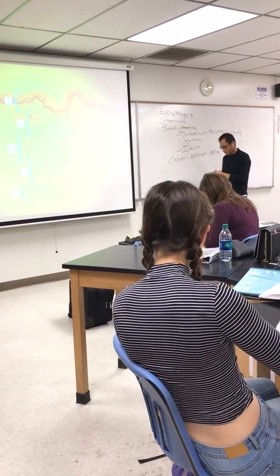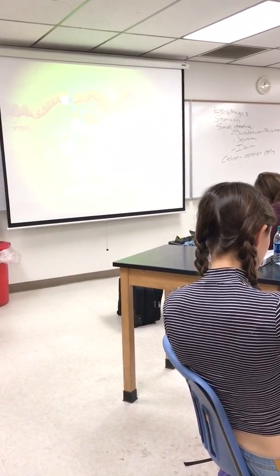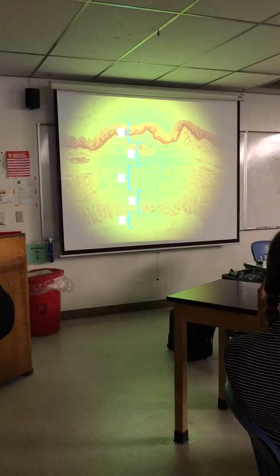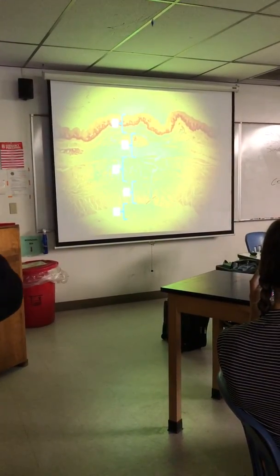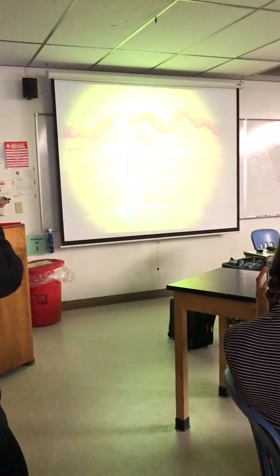So I'm going to turn off the lights. I know it's hard to see in the dark, but I'll leave that up there. This is the esophagus. And basically, you're seeing the whole thing under low mag. And the reason why I have the labels here is so I can ask you to identify the different layers. That's mucosa, that's the submucosa, that's the muscularis externa, that's the circular, that's the longitudinal layers, and then that's the serosal adventitia tissue, although it's very light.